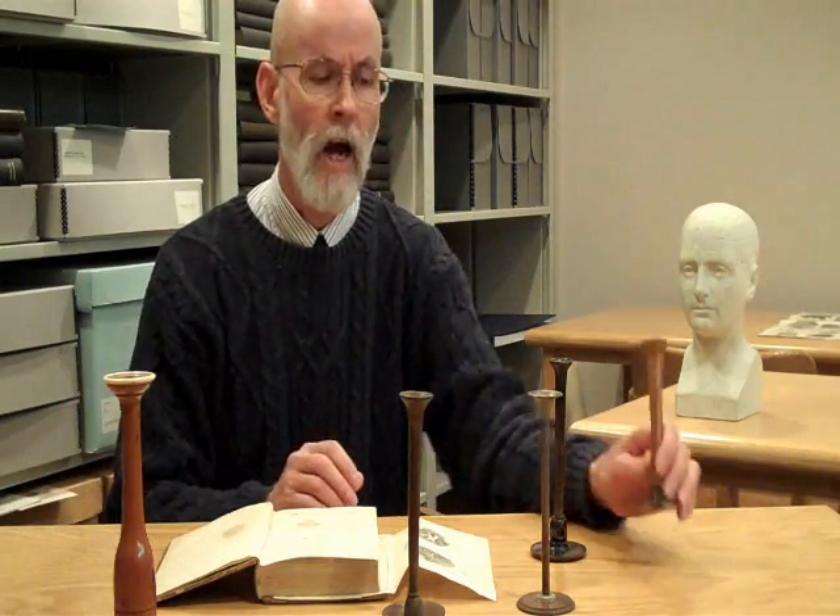Do any of these stethoscopes have Rochester connections — did they come from here or someone around here? We don't have the provenance for any of these, so we really can't say. We don't know that this stethoscope was used by a physician in Rochester or came from someone's home or office.